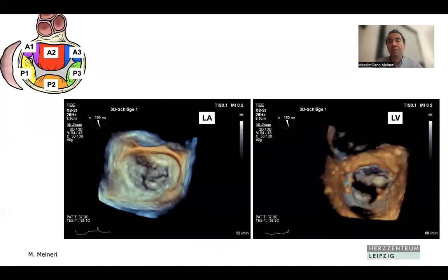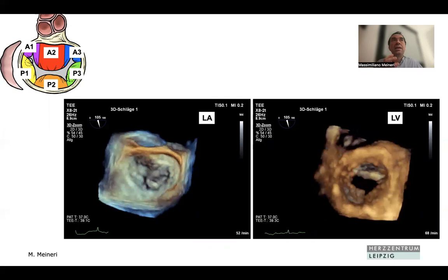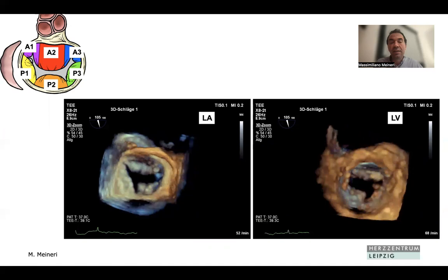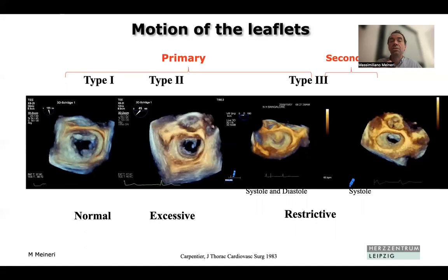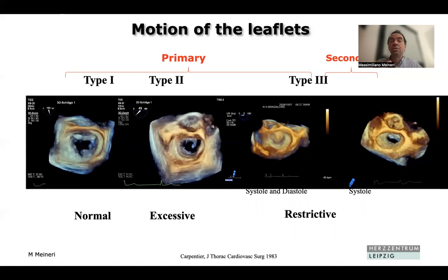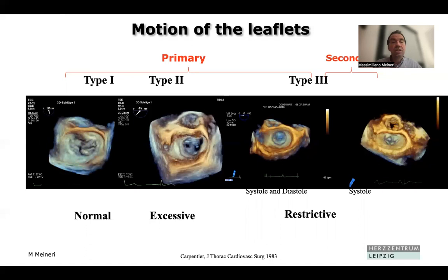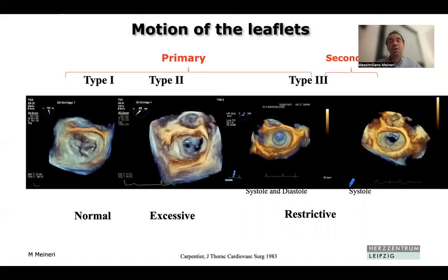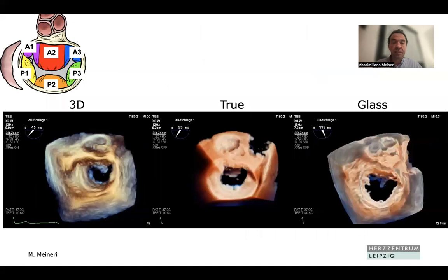Now we have 3D imaging, and 3D really allowed us to fully appreciate the complex anatomy of the mitral valve. We can obtain a block of the mitral valve, look at it from the left atrium down into the ventricle — seeing the valve just like the surgeon sees it — or flip it and look from the ventricle to the atrium. The 3D en-face view, or surgical view, shows the anterior leaflet at the top, the aortic valve at 12 o'clock, and the posterior leaflet at the bottom, allowing us to identify the cause of regurgitation immediately.